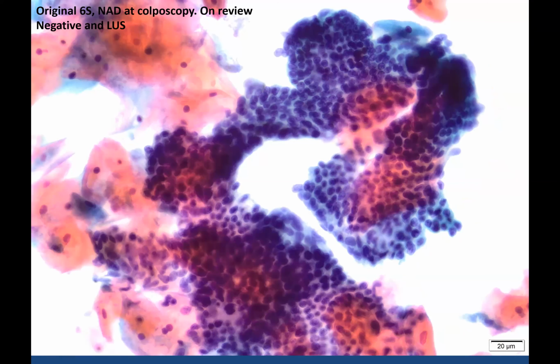And once again here, another example of lower uterine segment. No significant pleomorphism, no feathering at the edges. In this instance, I'm not really seeing the stromal cells, but often you can see them associated with it.